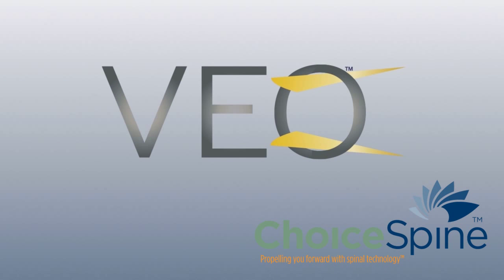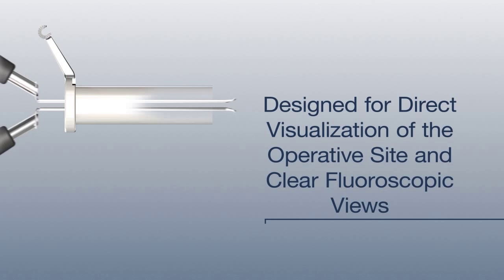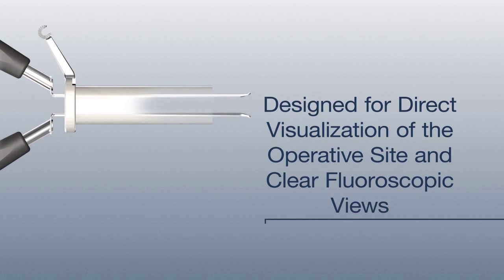Introducing the Veo Lateral Access and Interbody Fusion System. Seeing is believing. Veo is designed to bring clear and direct operative visualization to lateral fusion surgery.